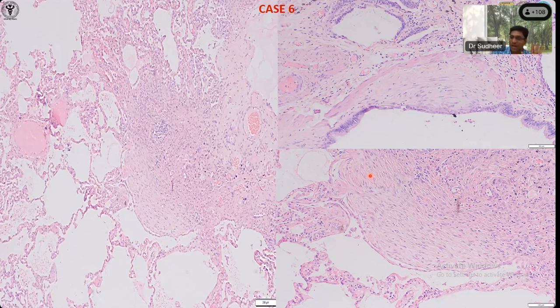In this, we identified multinucleated giant cells, cholesterol clefts, and peribronchial inflammation that made us think that it is a hypersensitivity pneumonitis. Even if you observe these cases, you do see Masson-like bodies in a fibroblastic proliferation here, and there is fibroblastic proliferation here within the alveolar, pushing towards the inside of the alveolar lumen. There is fibroblastic proliferation within the bronchial wall.